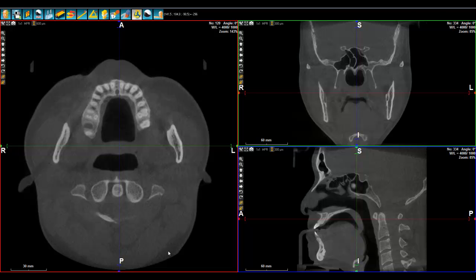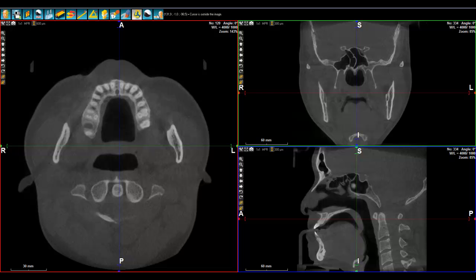One of the nice functions on WhiteFox Imaging is volume calculation. If you are able to isolate any type of window or range of Hounsfield units, you can display it in 3D and ask the software to calculate the volume for you.